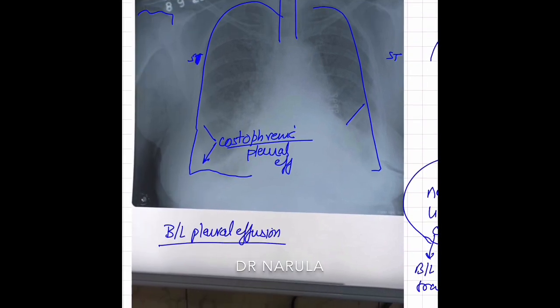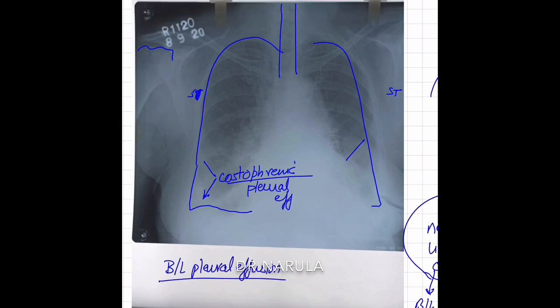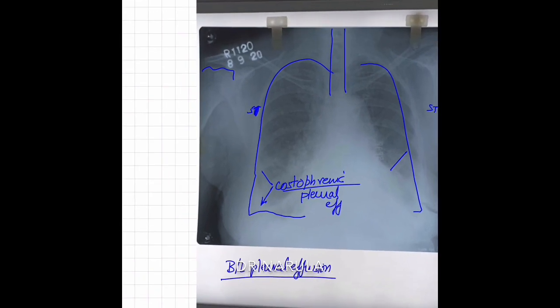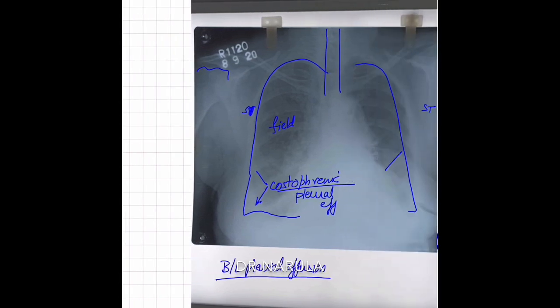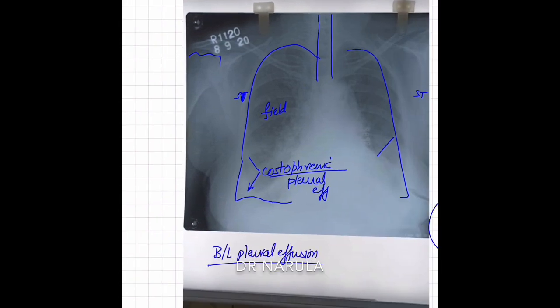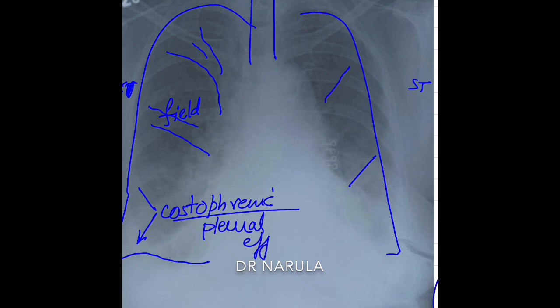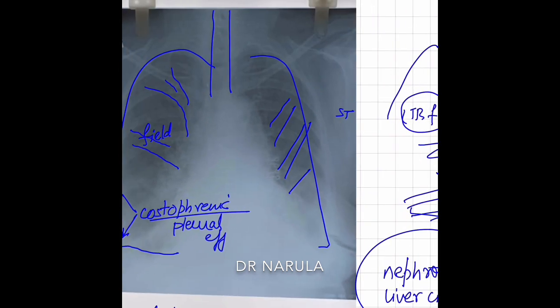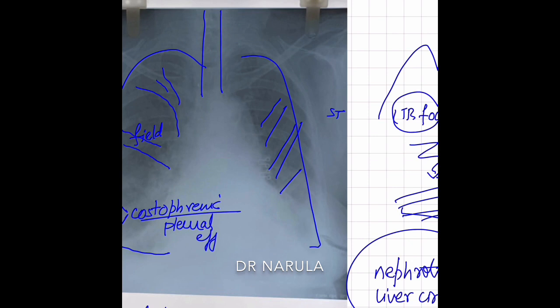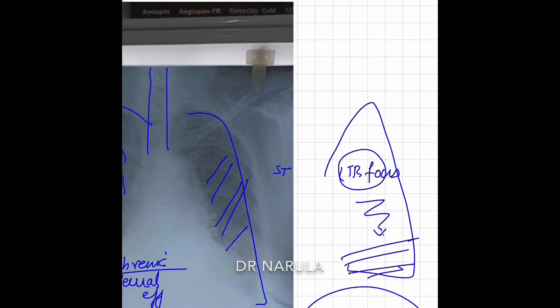Now, the costophrenic angles are obliterated on both sides. If you look at this lung field and compare with a normal X-ray, it doesn't appear as black. If you trace one vessel here, you can almost trace it all the way to the end — you can follow the vessels nearly to the periphery of the lung field.